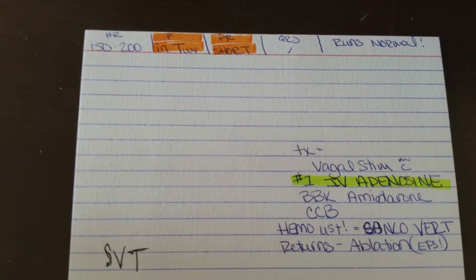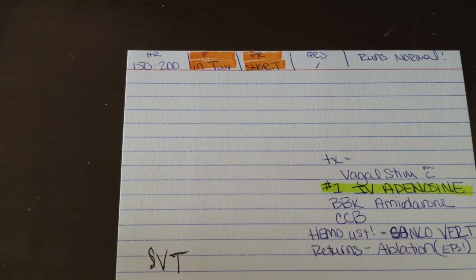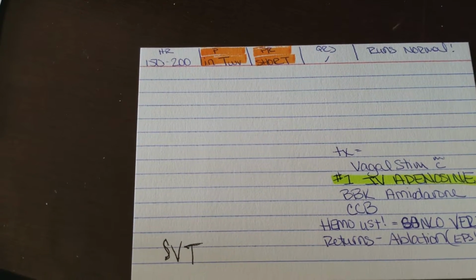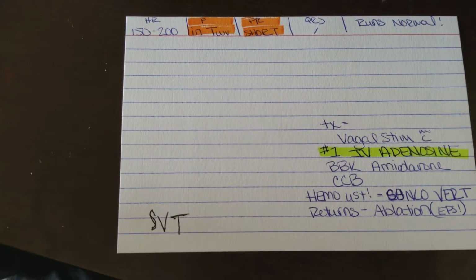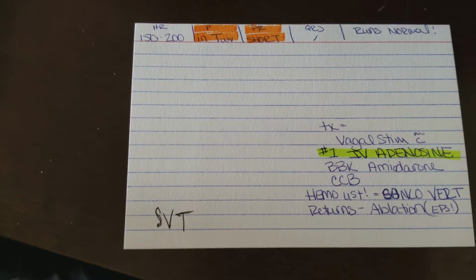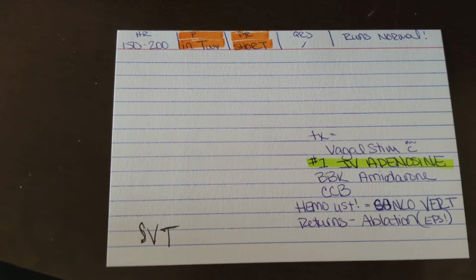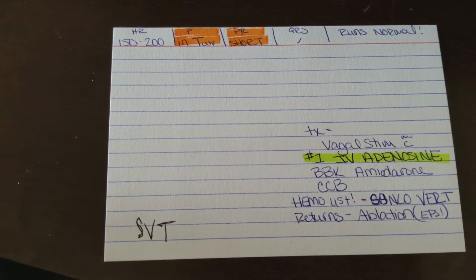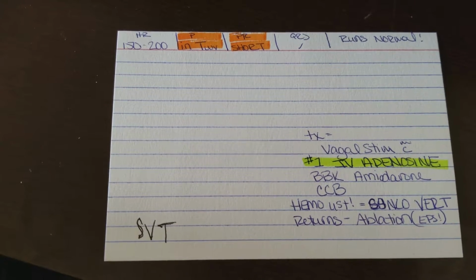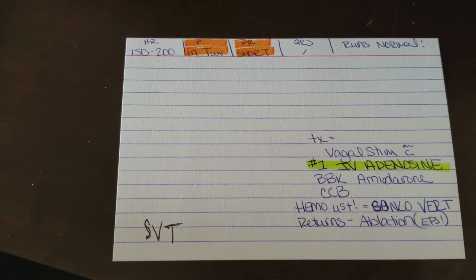All right, SVT or PSVT, this is an atrial rate of 150 to 200 and regular or slightly irregular. The P wave may be hidden in the T wave, and it is an ectopic focus anywhere above the ventricles. Paroxysmal, so it may be followed by a brief period of asystole.